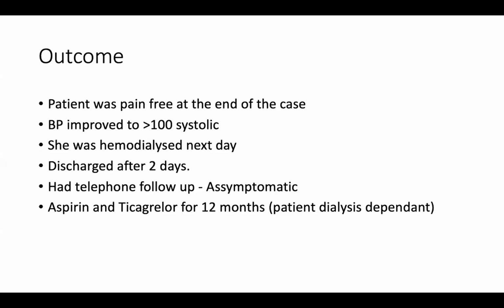So always give a heads up to your anesthetic team and let them know that you have a sick patient. Here, fortunately, as soon as we backed out the guiding catheter, and this is an important point, the pressure would recover. So the important learning point here is don't always believe your eyes. Your eyes are good, but the IVUS is even better.